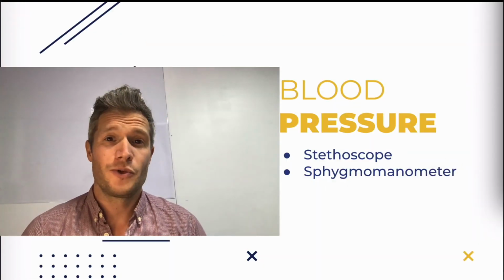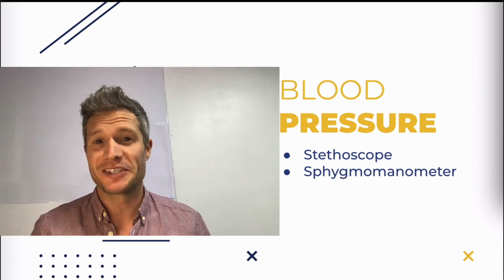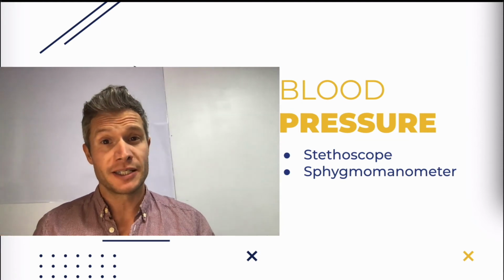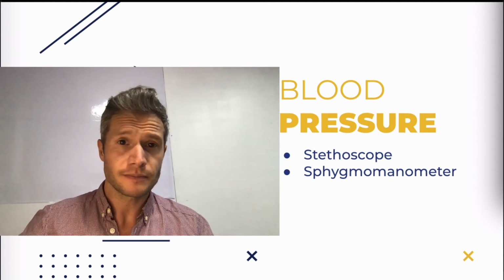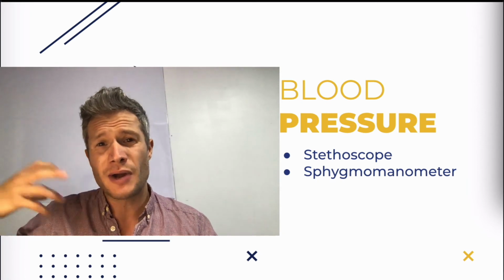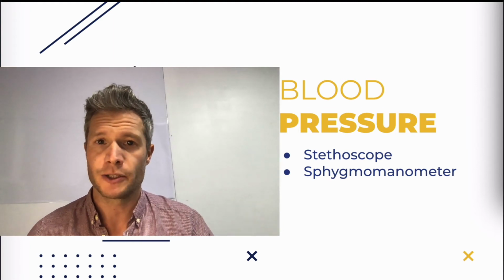Next up, you're going to be learning about blood pressure and how to take someone's blood pressure, which is really cool. It's lots of fun. It's a little challenging. It's a skill that needs practice. And on top of that, for this class and this lab, you're going to need to know what you're doing while you're doing it. So what are you actually measuring in someone's body as you gain all this information through taking someone's blood pressure?